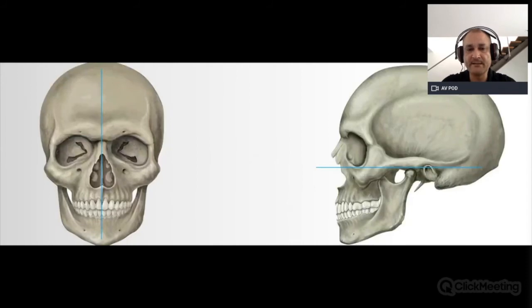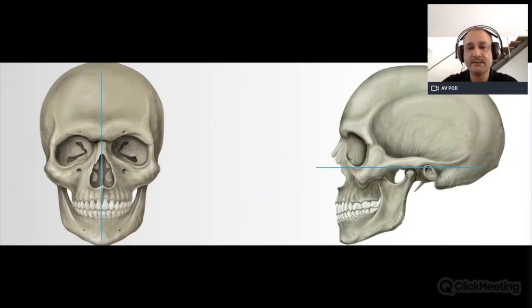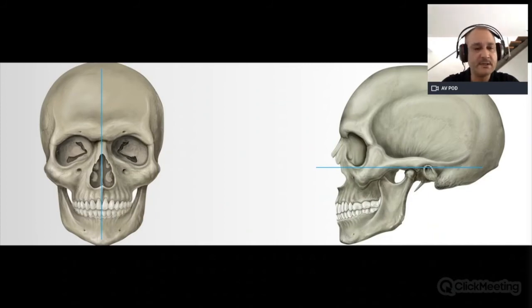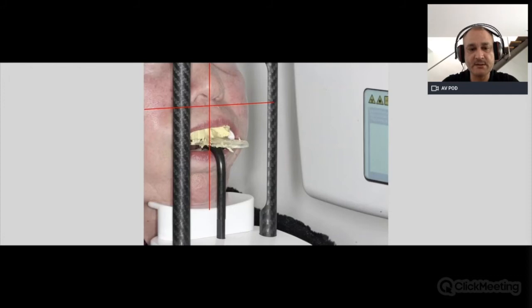That's an example of how the patient should be placed on the machine — we always have to check these two planes: the Frankfurt horizontal plane on one side and the mid-facial midline on the other.